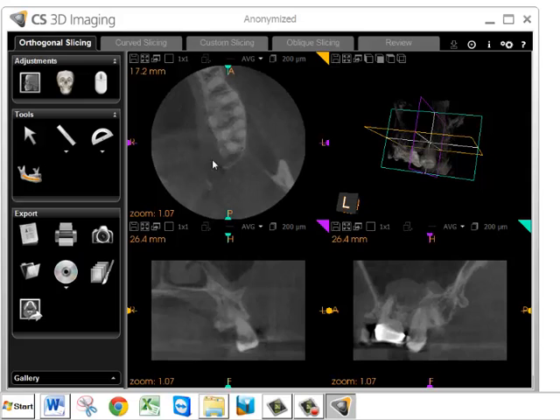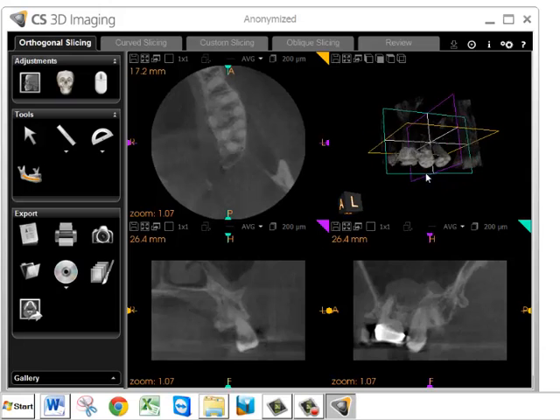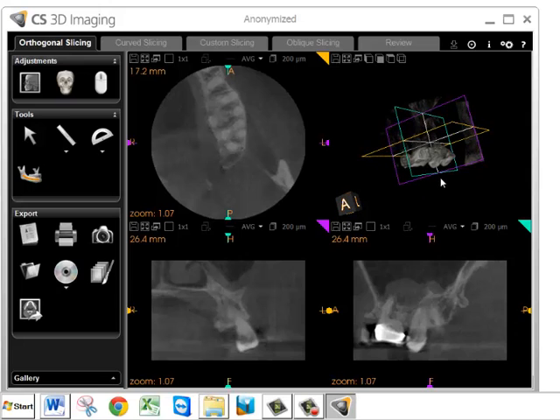You'll notice that the three windows are color-coded. The yellow is the axial view, which is a slice that's parallel with the floor. The purple is the coronal view, which is a slice from ear to ear. And the green is the sagittal slice, from front to back.